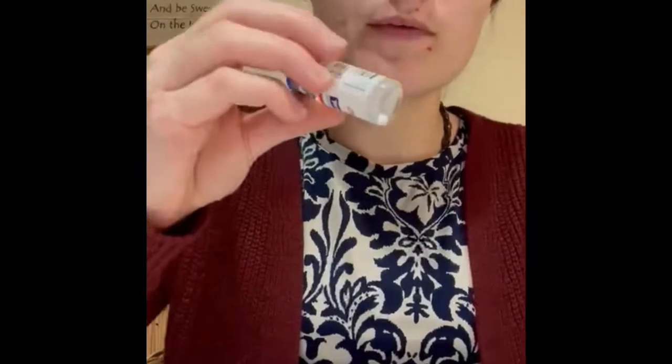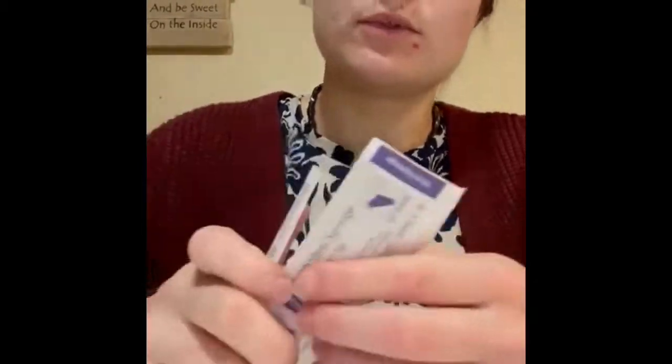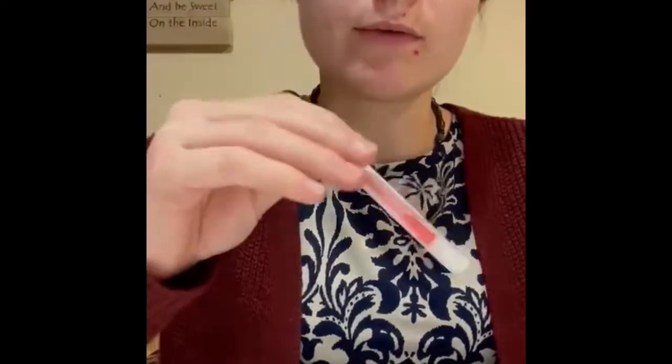So with 12 of these, we'll need 100 ml normal saline. We'll need a solution set, which I don't have. And then we need 12 10 ml syringes, and our blunt fill needles, we'll need 12 of them as well, because we're going to draw each individual separately. I don't have 12, so I'm just going to go through the one.